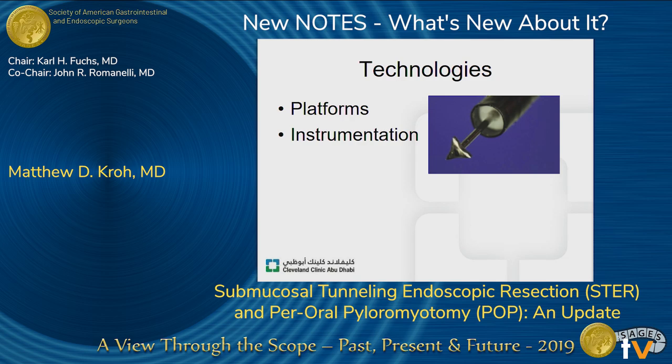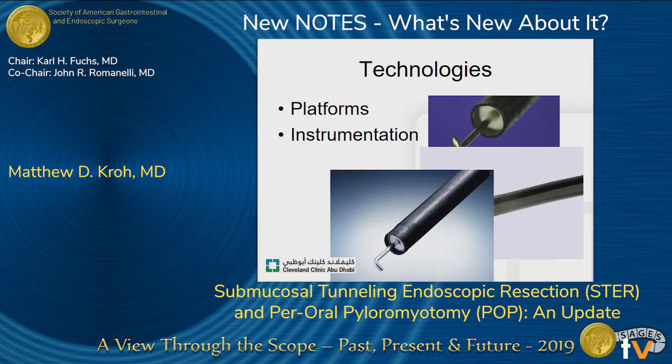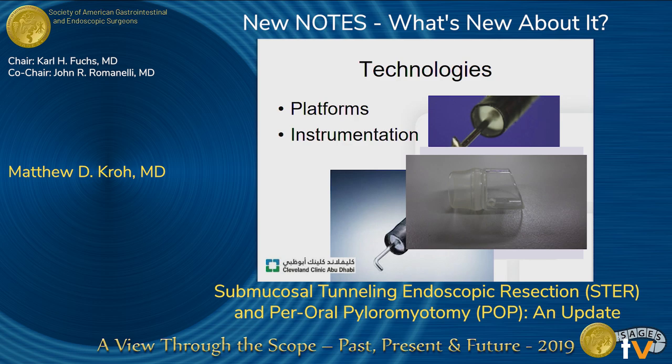Well, endoscopic platforms are allowing us to do more complex procedures in the confines of either the luminal GI tract or within the wall of the GI tract, and instrumentation. So the tools, such as this triangle tip knife, IT insulated tip knife, or hook knife that you've seen, are starting to look much more like our laparoscopic instruments to divide, retract, as with a cap, and perform surgical procedures on the end of an endoscope. So really, this is the confluence of surgery and endoscopy, and is surgical endoscopy.